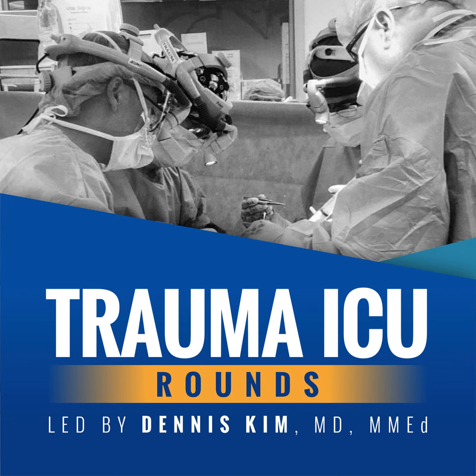When breaths are patient triggered, the CMV mode is oftentimes referred to as assist/control, or AC, and volume AC is probably the most commonly employed mode of ventilation worldwide. In assist control, or AC, patients are capable of initiating an assisted breath, which has the same tidal volume set by you, the clinician, but if this isn't possible, mandatory ventilator breaths are delivered at a pre-selected interval, again, machine or time triggered. So just to summarize, the only difference between CMV and AC is that in AC, the patient may trigger the ventilator, whereas in CMV, the breaths are time triggered.